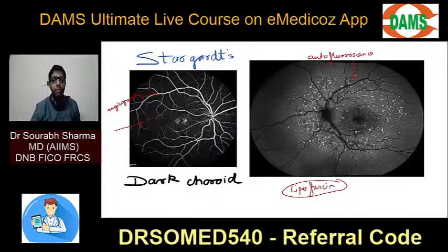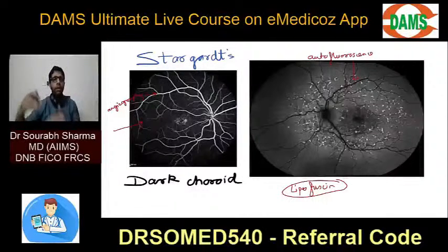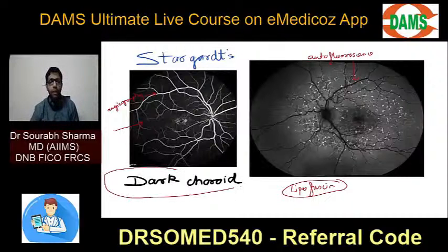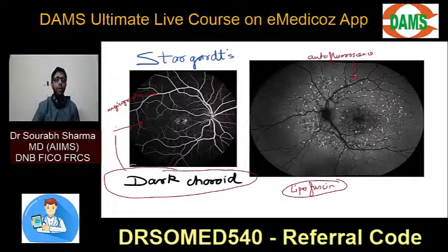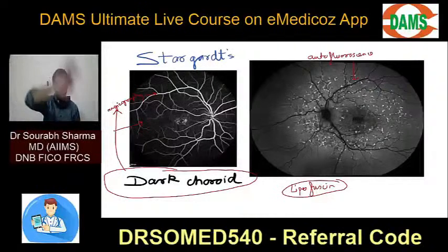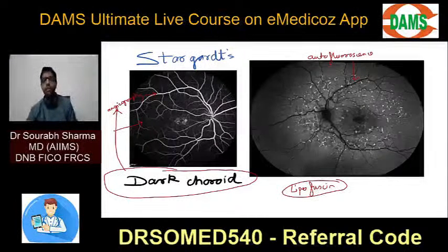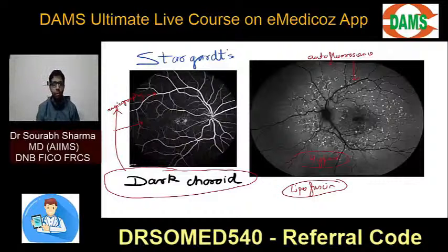So what will happen in angiography? This was a JIPMER question last time. If it is deposited all over the retina, the choroidal vessels are not seen; they are blocked. So that is why you get a dark choroid on angiography. Lipofuscin is deposited all over the retina, so choroidal vessels will not be seen. There is dark choroid on angiography. But on autofluorescence, there will be hyperfluorescence because they have a property of emitting a higher wavelength light.